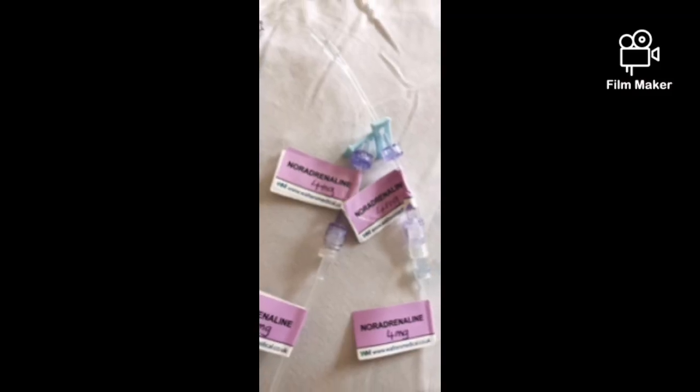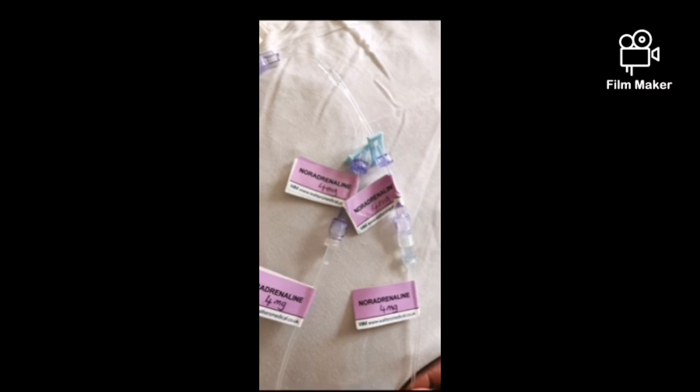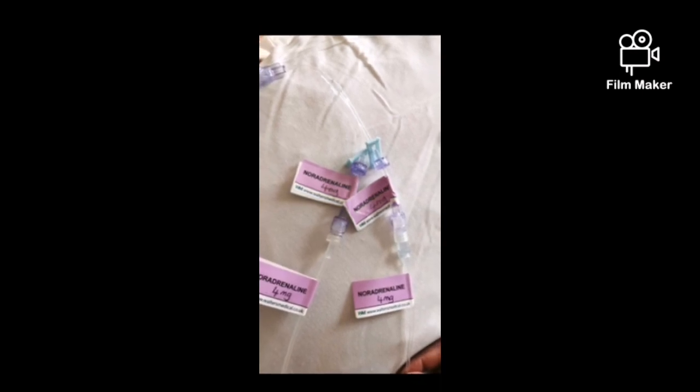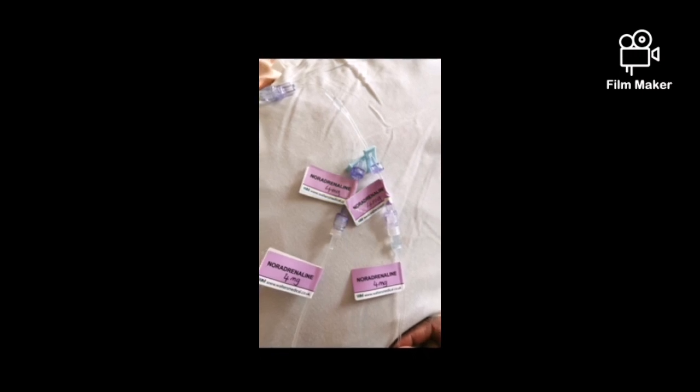When double pumping, your lines should always be left like this. You should never have a vacant port unless you have just set up the infusion. This is a safety feature to stop any boluses being given down the spare lumen.